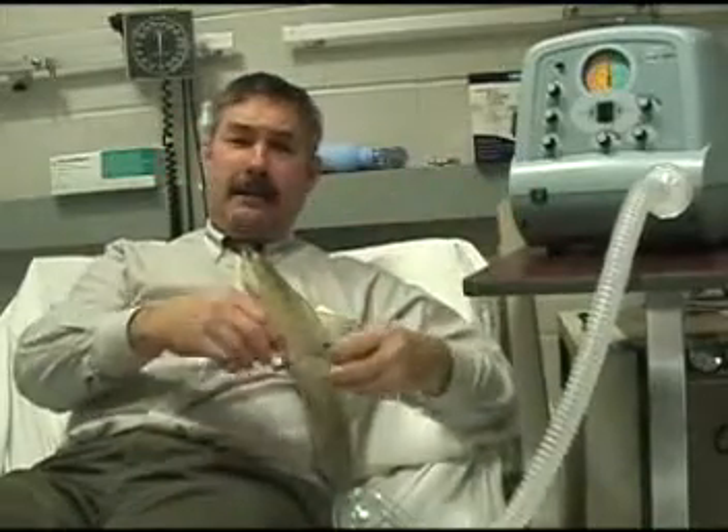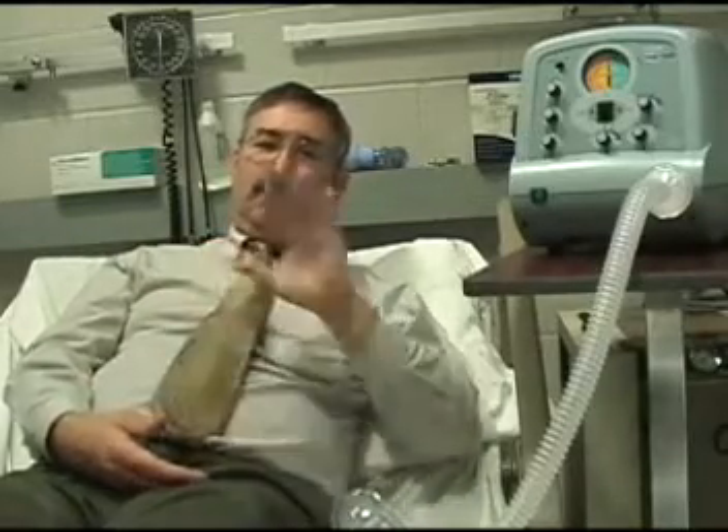Make sure that you clean off the mask in between patients. I haven't had any problems with secretions, but what you want the patient to do is relax, allow the air to fill up the lungs, and then during the exhale period you can feel the air being pulled out of the patient's lungs. I would be doing five more cycles of that, and at the end, if I had secretions to cough up, I would. So basically, this is all you need to know about the Cough Assist.